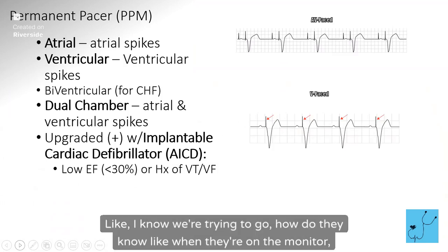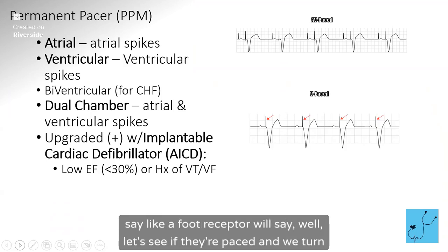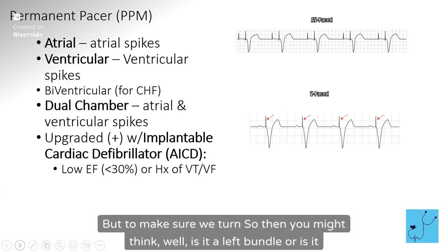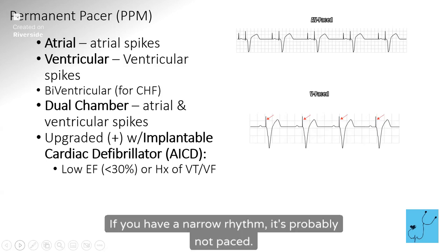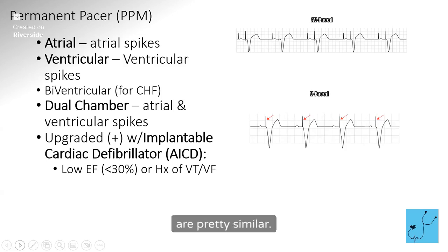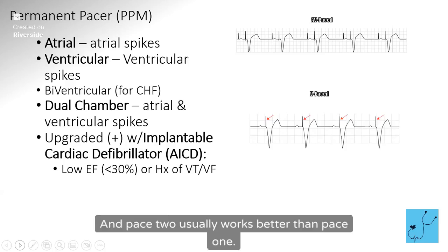How do we know when they're on the monitor? Sometimes the preceptor will say, let's see if they're paced, and we turn it on. How do you know? If you have an ugly rhythm like this, it could just be a bundle branch block, but to make sure we turn it on. You might think, is it a left bundle or is it paced? If you have a narrow rhythm, it's probably not paced. It could be atrial paced, but the number of people who are just atrial paced is pretty slim. If you have a wide QRS and the rate is okay, at 60 and above, then check the pacer. And pace 2 usually works better than pace 1.